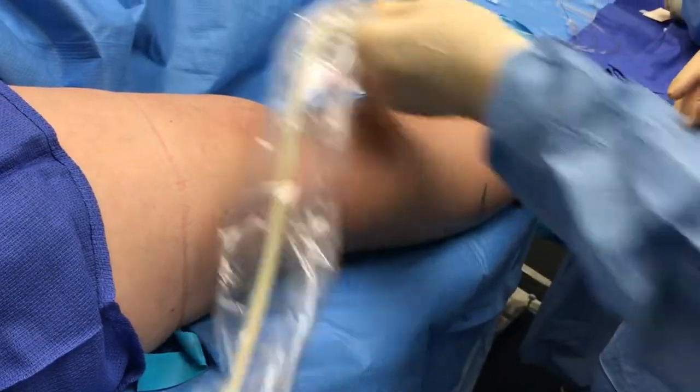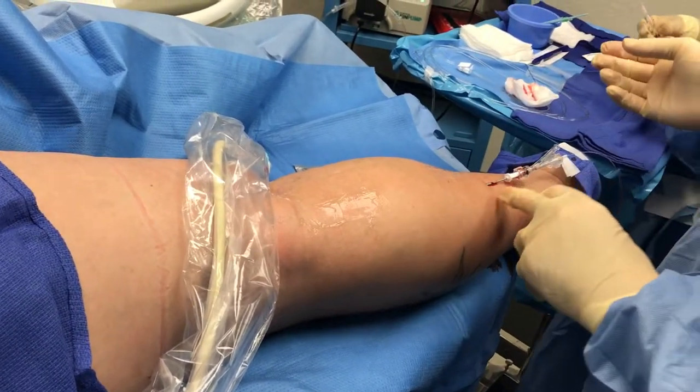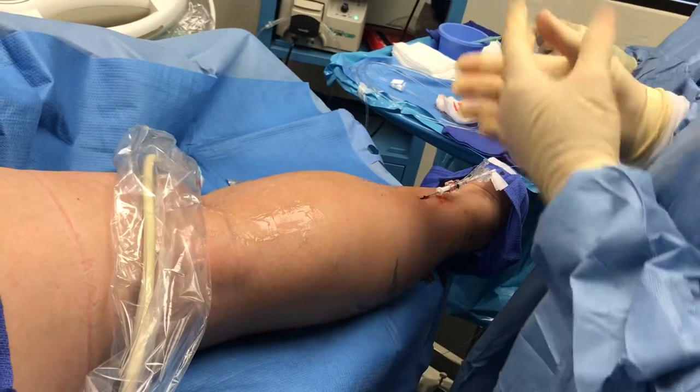You can see up here now there's a red sign — that's where the tip of the laser is, and that's in good position. The next step is to push the vein down onto the laser fiber and to push the other tissues away.